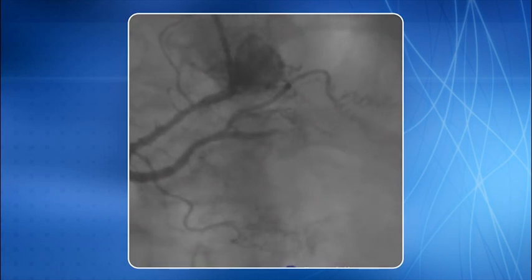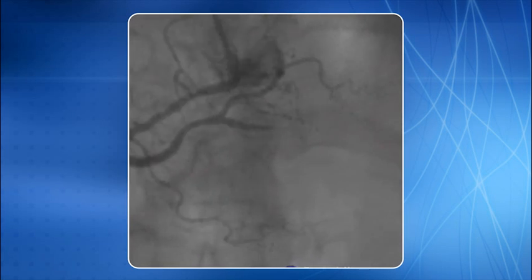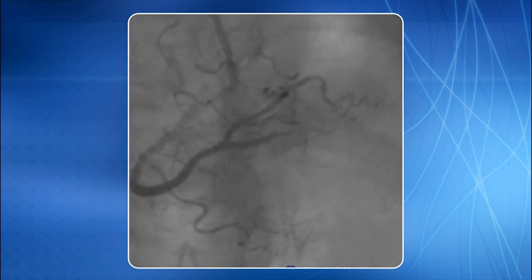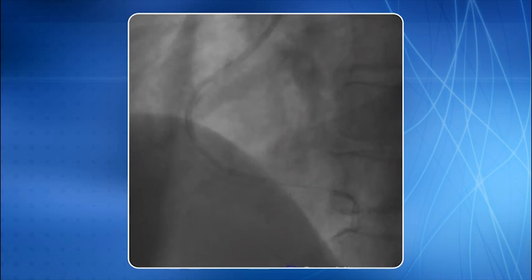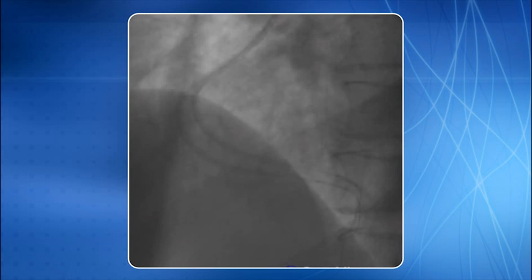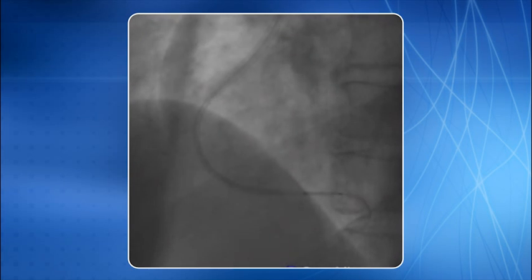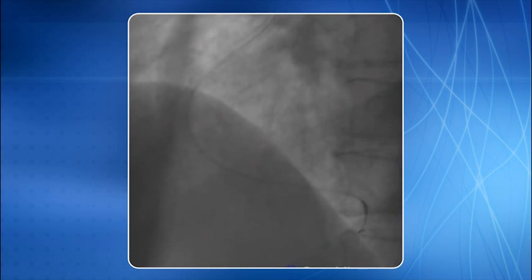Here is a nice example of the deep intubation technique performed in the RCA. The patient had a long-standing occlusion of the PDA artery. Deep intubation was performed for entry of the balloon across the CTO. A gentle counter-clockwise rotation was then performed to bring the catheter back to the normal position. This is the end result after stenting.